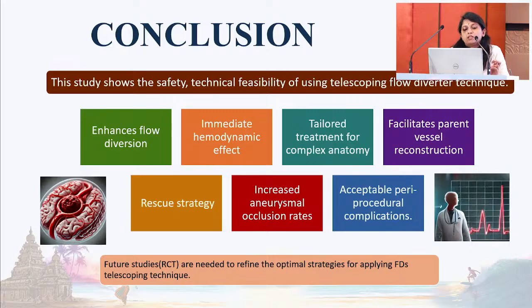This enhances flow diversion treatment for complex vascular anatomy and parent vessel reconstruction. Future studies are needed to define the optimal strategies for applying the FD telescoping technique.